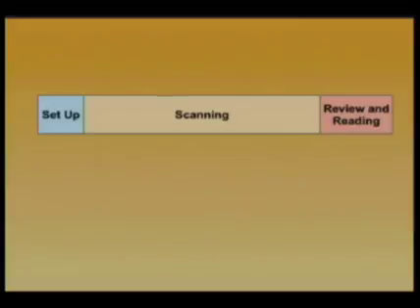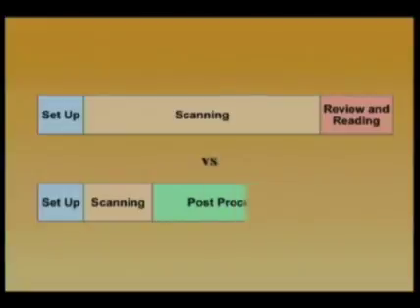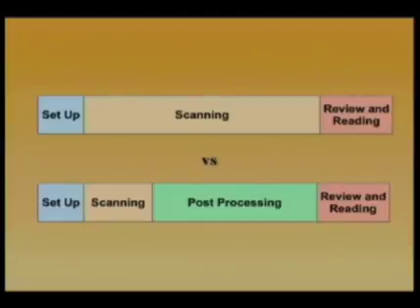In my opinion, however, both these suggested workflows may have problems, because if you add 3D post-processing to the workflow and it takes more time to do than it took with the 2D method, then you haven't really gained anything, unless you can convincingly demonstrate that the added time of post-processing shows you information that you absolutely could not get any other way. And I think we're not quite there in the abdomen yet. So I think we need to make sure that whatever 3D workflow we use doesn't add an inordinate amount of time to the total amount of workflow.